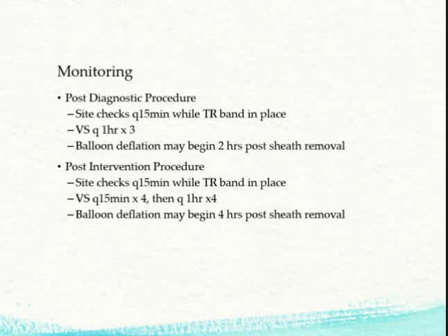So, monitoring. While the TR band is in place, if the patient has had a diagnostic only procedure, you will do site checks every 15 minutes. Vital signs will be monitored every hour times 3, probably more frequently for us because they're usually hooked up to a monitor that slaves into our charting. Balloon deflation with the TR band will occur passively over the 2 hours the TR band will be in place. The last half hour you will actively deflate it, but we'll talk about that on the next slide.